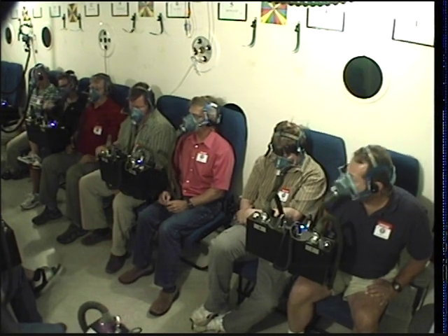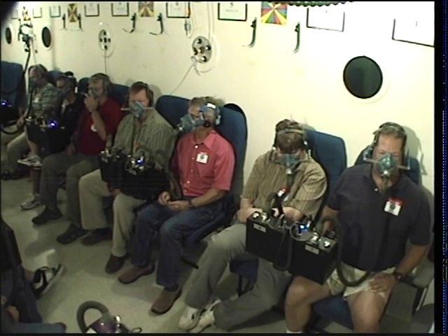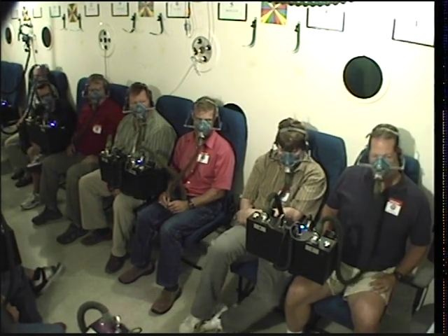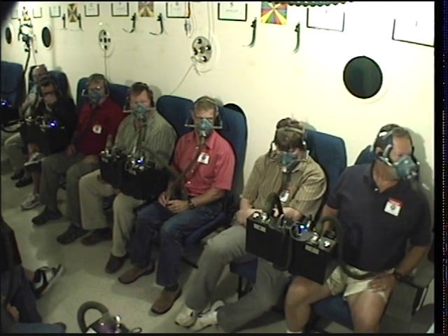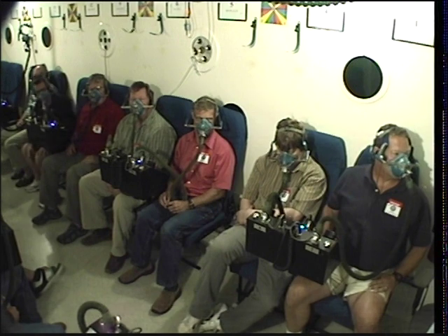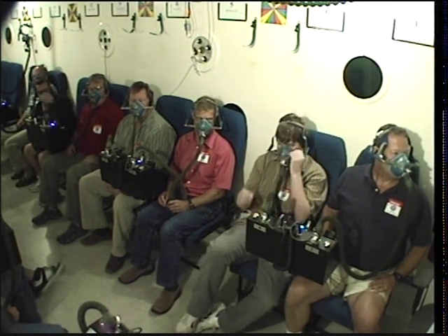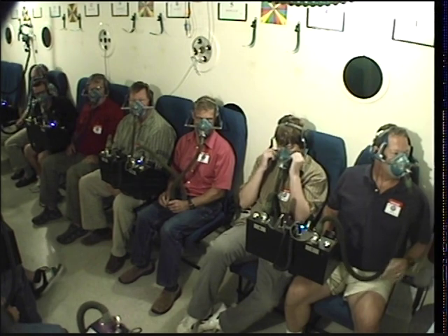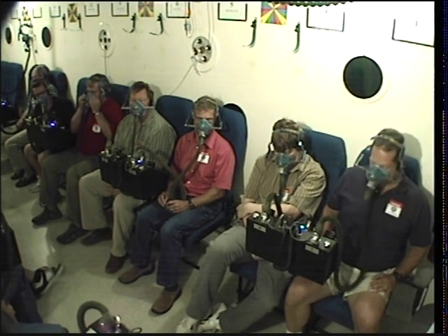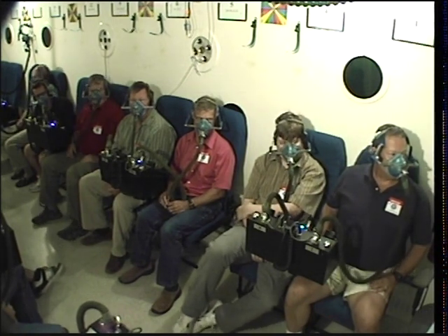Now, from that point on, we're going to let you stay off for 5 minutes, just like you were able to do at 25. The difference being, even though we've only gone down a couple thousand feet, our time of useful consciousness is going to expand quite a bit. At 18,000 feet, it's in the realm of 20 to 30 minutes. So we're looking at a little bit less than that, so we actually take our mask off at 22. But it's going to be much greater than 5 minutes. All right, we're at 22, so go ahead and take your mask off.